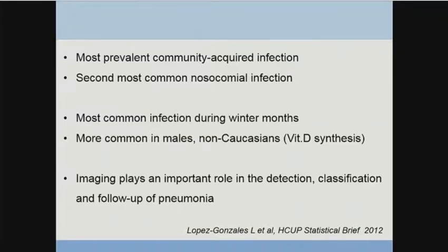Imaging plays a big role in the detection, classification, and follow-up of pneumonia, and this is why we will spend a number of cases in the next 30 minutes or so to discuss these important roles of imaging.